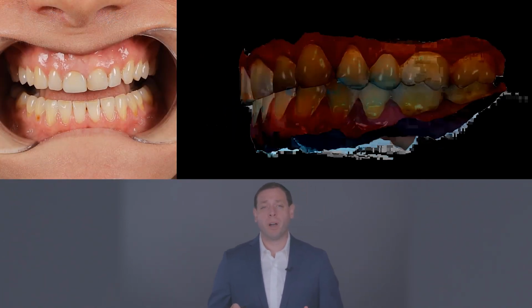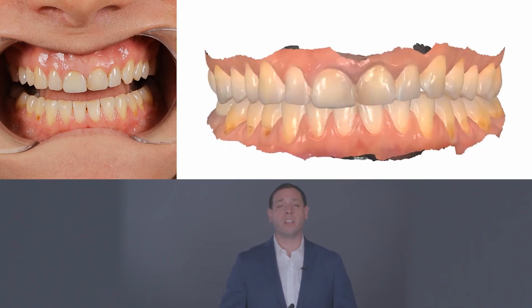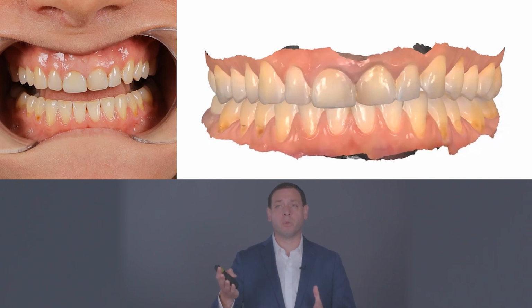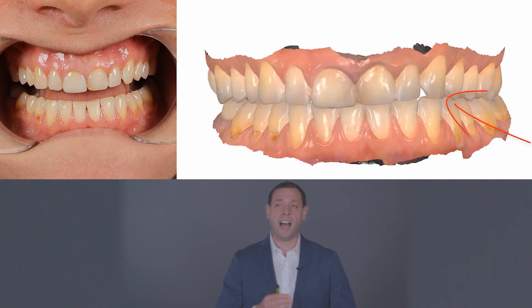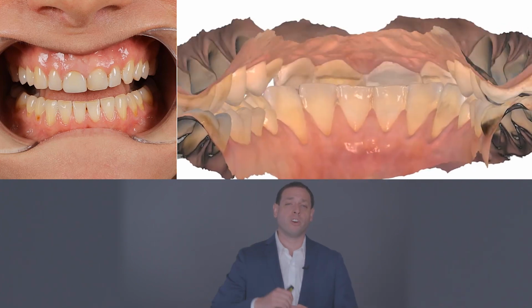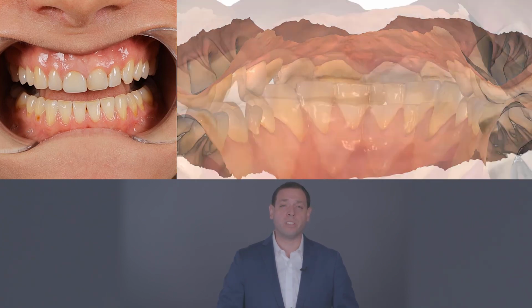As I was saying before with patient monitoring, when we have patients who are meeting in our consult room and the patient's telling us, oh no, I don't grind. Well, this is the type of conversation we're having, where we can look together and I can point to a certain area and say, I do think that you're grinding, and let me show you why I think so. Let's go stand, for argument's sake, as if we're on your tongue. And let's look at some of the areas that we see here.